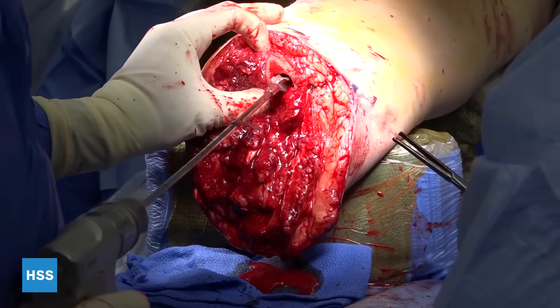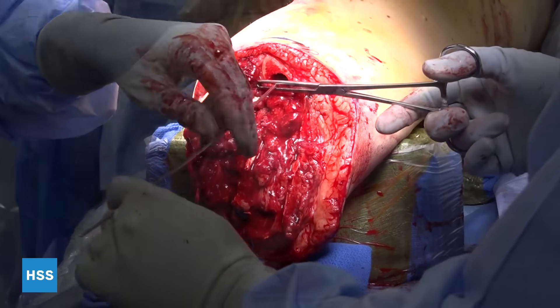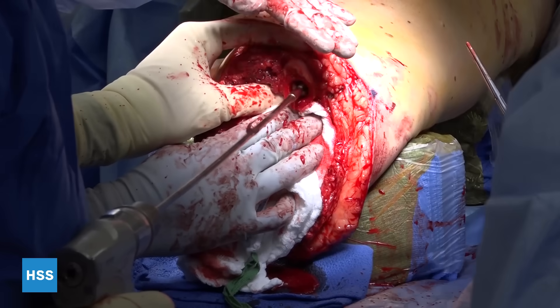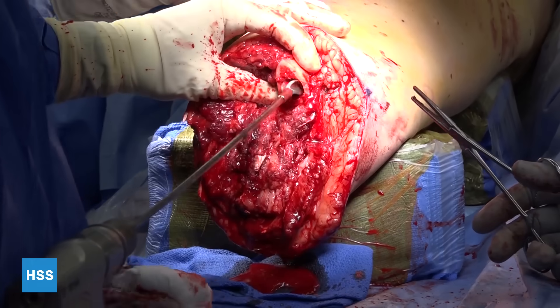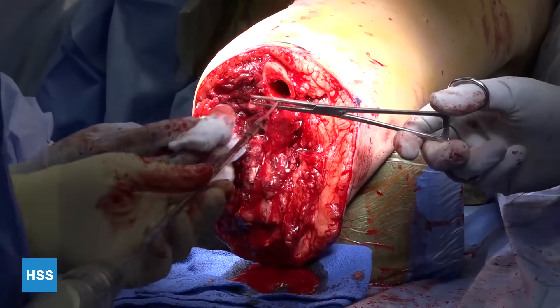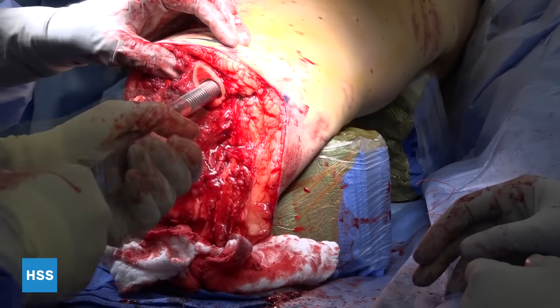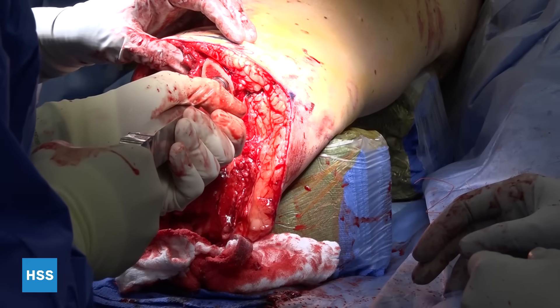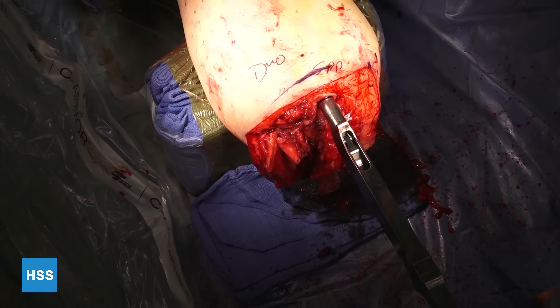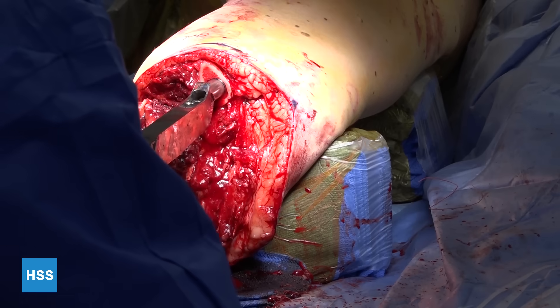Reaming is done up to the appropriate length so we know exactly how long the implant is. In the tibia, we really focus the reaming on the diaphyseal part, and I tend not to ream all the way up into the metaphysis because I'm trying not to remove that bone. Rasps are then used to prepare the bone, impact the bone, and make sure that the size is appropriate for the implant.